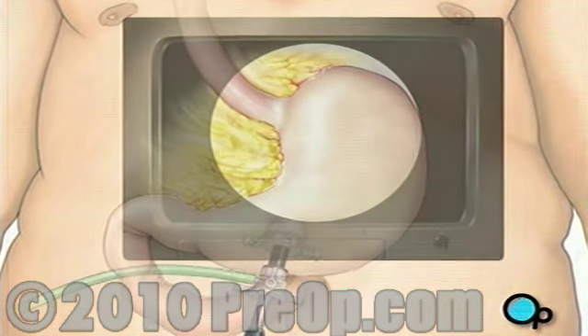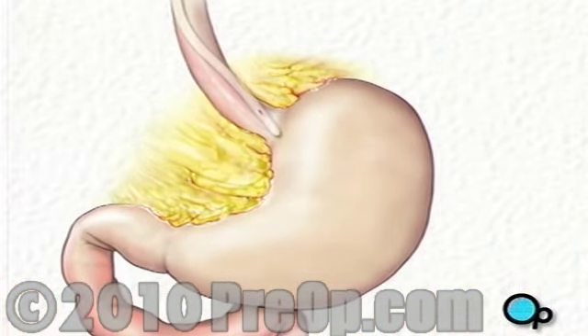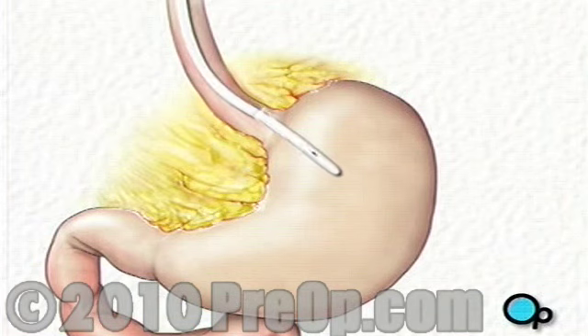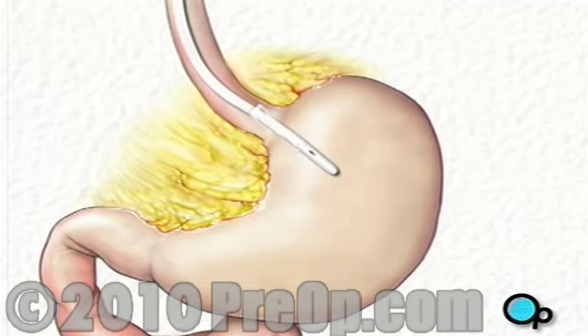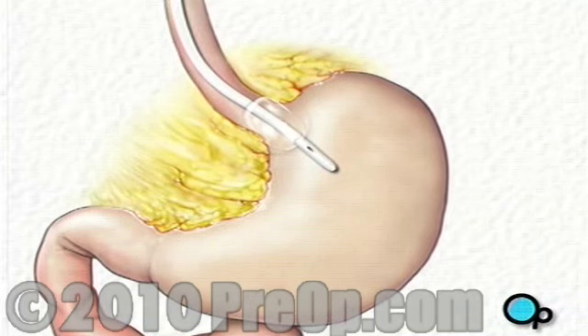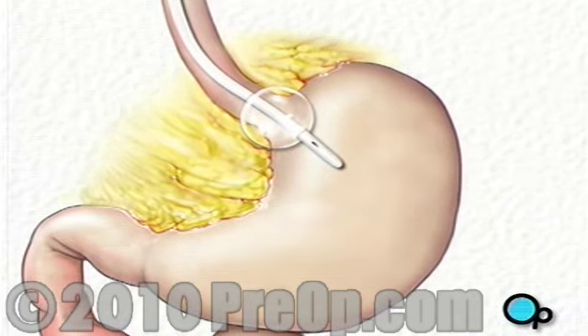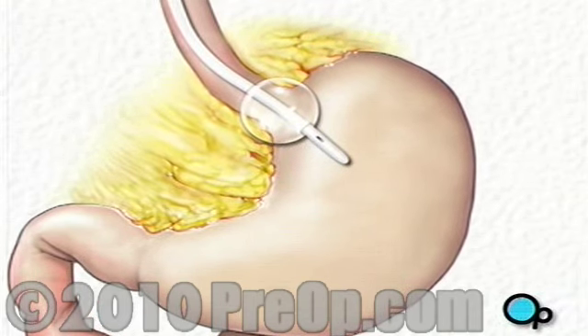Once the team has a clear view of the stomach, your doctor will insert a special tube into your mouth and throat. The surgical team guides the tube into your abdomen until the tip reaches the top of the stomach. At the tip of the tube, there is a balloon. Your doctor will inflate the balloon when it is in position. Using the position of the balloon as a guide, your doctor will create a space around the stomach.